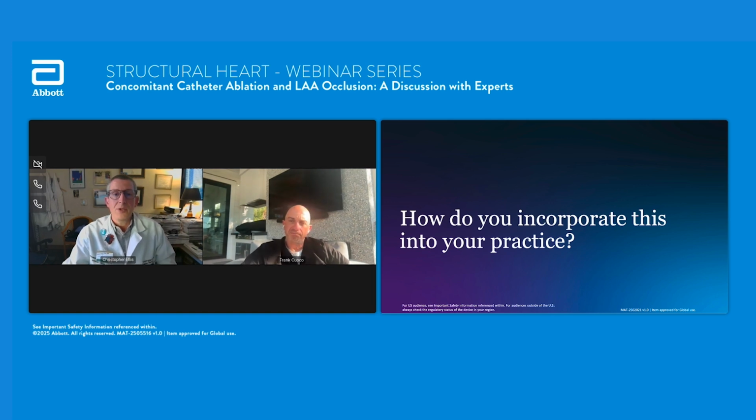So I'd be curious as to your method for closure, if you want to talk about that just for a sec, on vascular closure and your post, when you wake the patient up, where do they go? How long are they there? And when can they go home? So that's a good question. Yeah. So I think we currently do close all the groins.